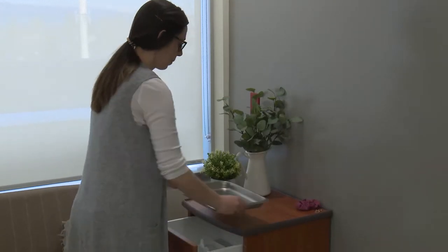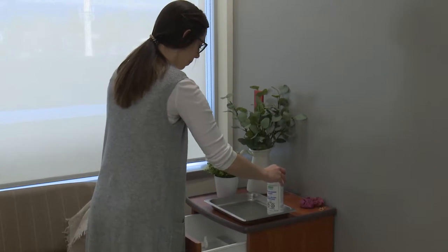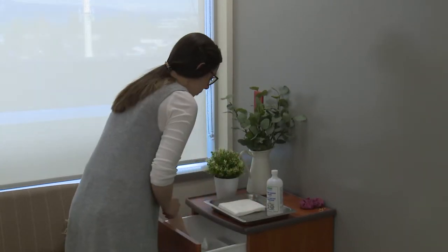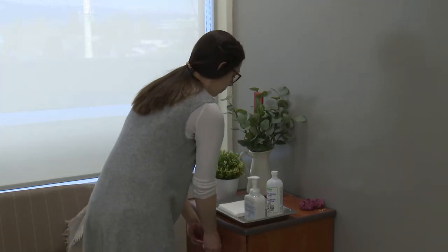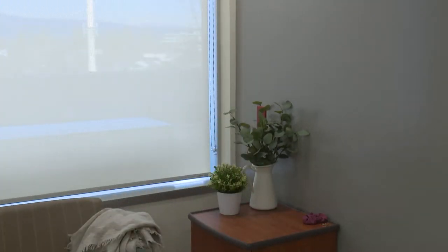In order to prepare your space, you will need a non-porous surface, like a stainless steel cookie tray, a glass baking tray, or a serving platter. You will need a bottle of alcohol cleaning solution, a freshly cleaned towel or clean paper towel, and hand sanitizer.